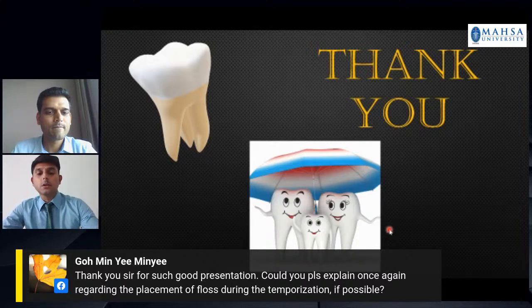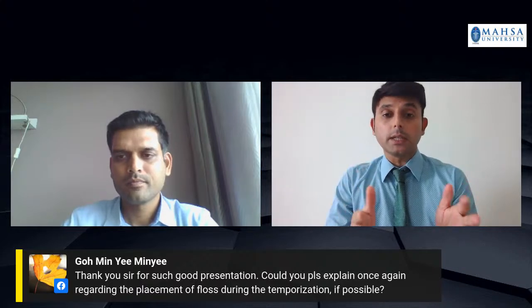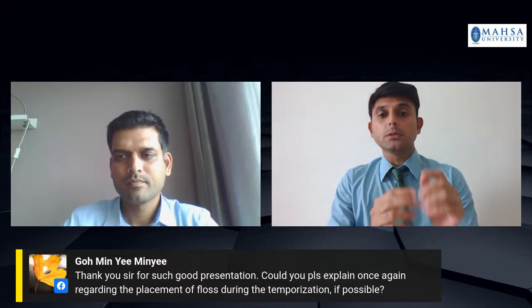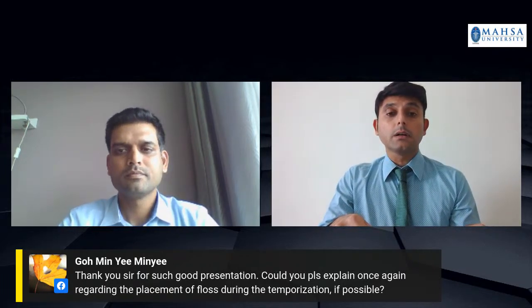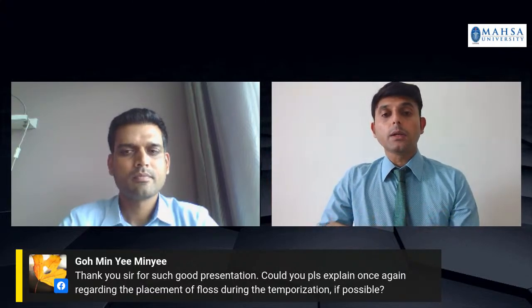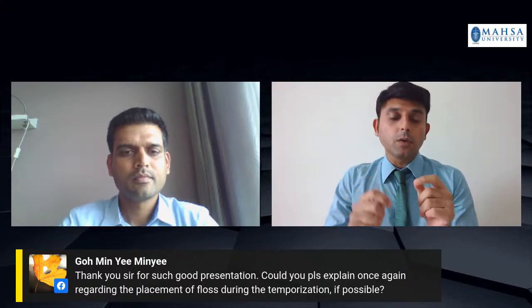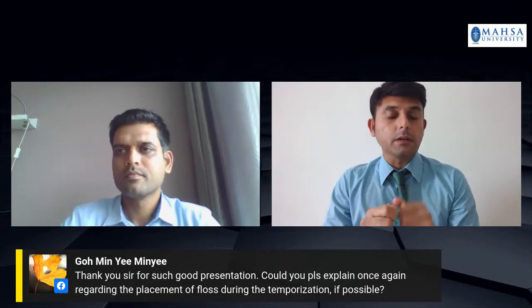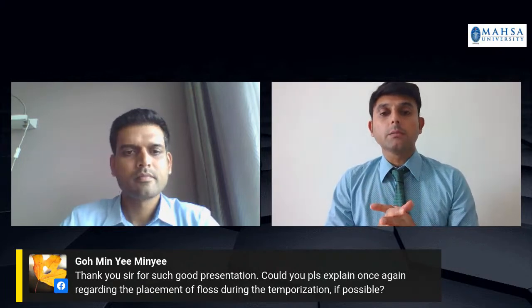Okay, sure. Once you have your putty index and temporary crown material ready, what you do is just place the floss adjacent to the abutment tooth. If it's the anterior abutment tooth, keep it at the distal, just below the distal gingival finish line, and if it's the posterior abutment tooth, keep it at the mesial finish line, and then over that you place the putty index. Of course it will need a little bit of experience to master that technique, but once you do that, it will be very helpful.